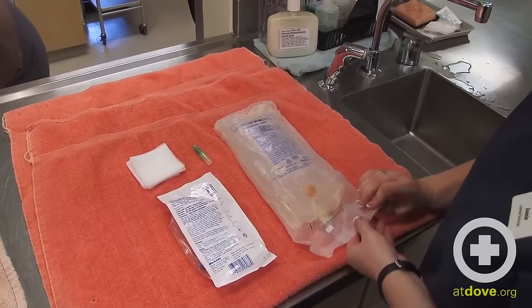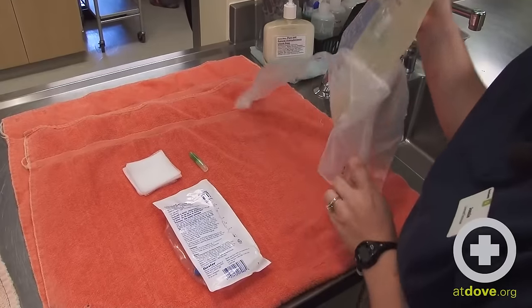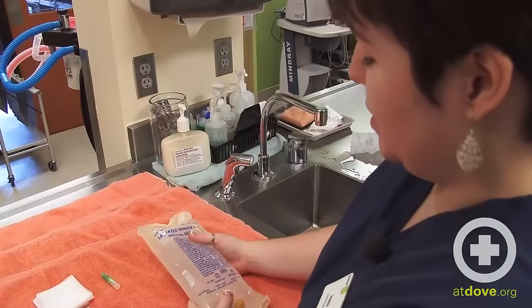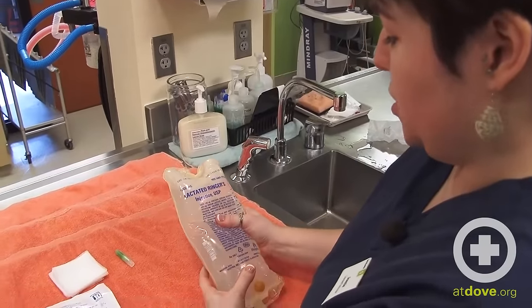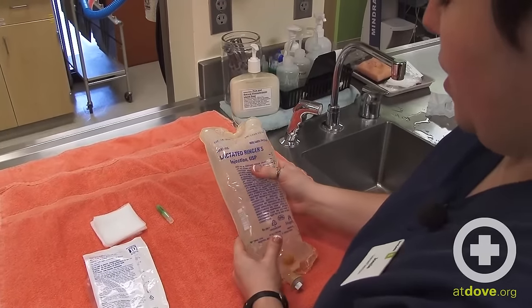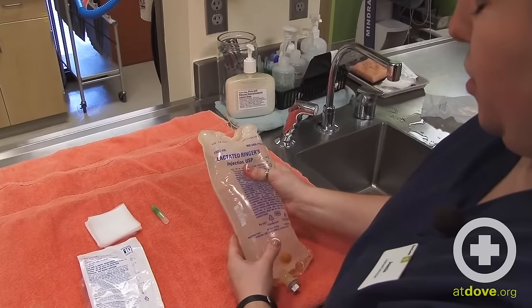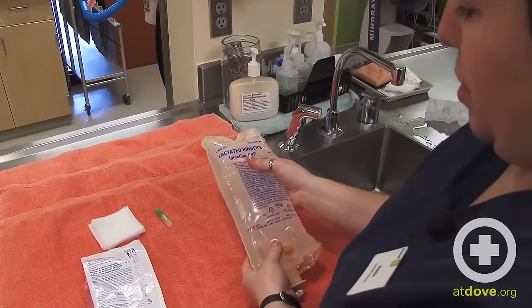To put these pieces together, just need to get everything out of its packaging. When you take the fluids out of the bag, you want to give it a visual inspection and a good squeeze to make sure that it's not leaking fluid from anywhere. It may be a little damp from the packaging, but there should not be a significant amount of fluid or a prominent leak coming from the bag.